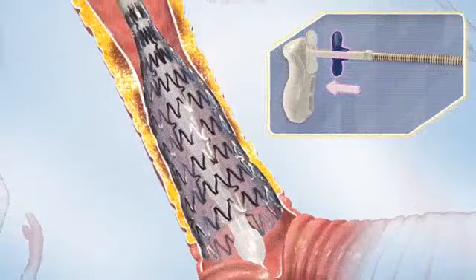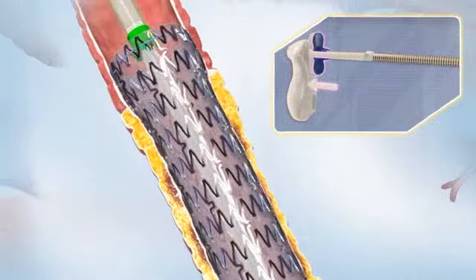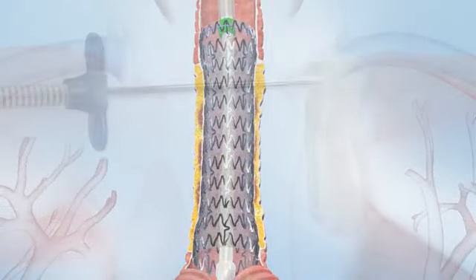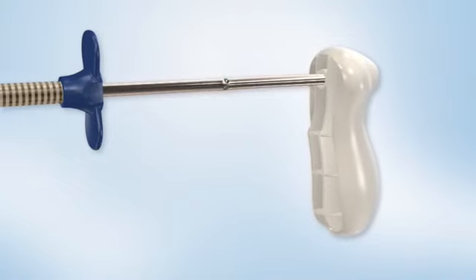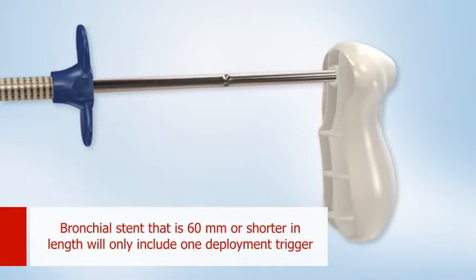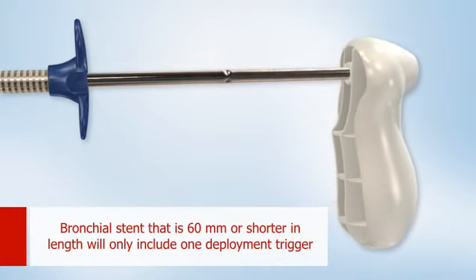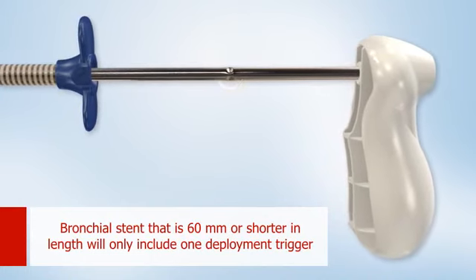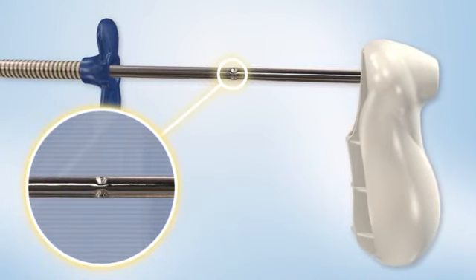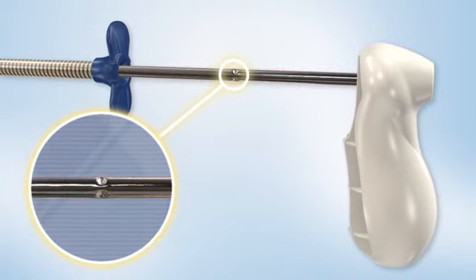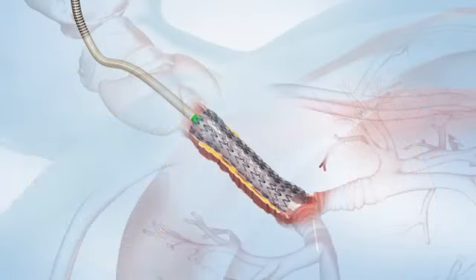Complete actuation of the second blue trigger will release the remainder of the stent body. As compared to longer stent systems, a bronchial stent that is 60 millimeters or shorter in length will only include one deployment trigger. There is a notch in the delivery system that indicates when the deployment is at 50 percent of full expansion.